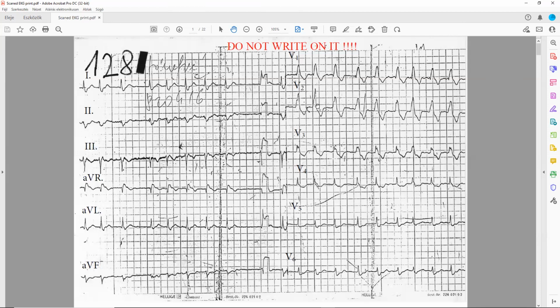If we do have an anterior hemiblock plus a right bundle branch block, that is called bifascicular block. Yes, that's a bifascicular block. All right, 2 fascicles are missing. Especially when we do have a right bundle branch block, very frequently we could have an anterior hemiblock as well, because the same coronary supplies these 2 areas.